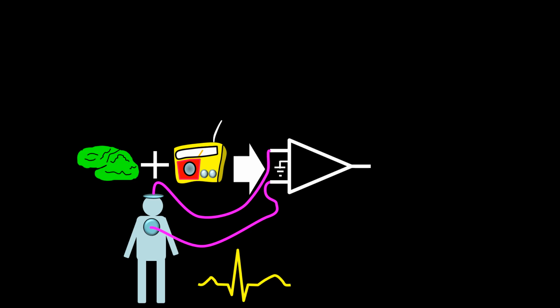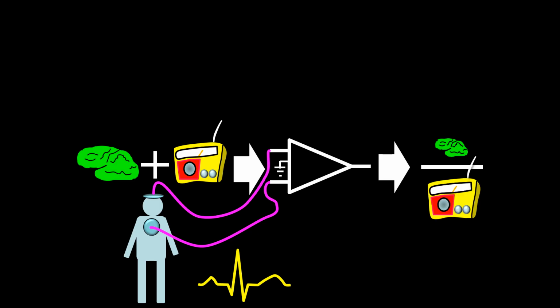But cardiac artifact was very prominent in the EEG epochs collected this way, to the point of often overwhelming the cerebral activity in many epochs, thus making all these epochs so collected unreadable.